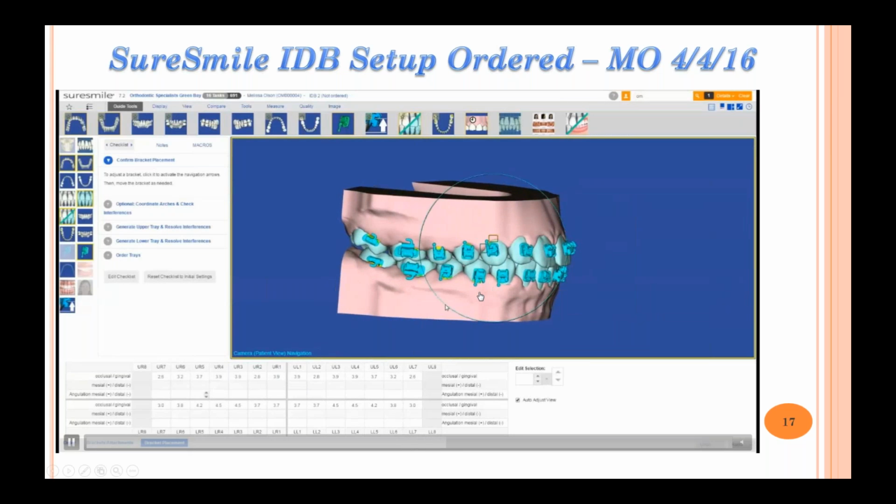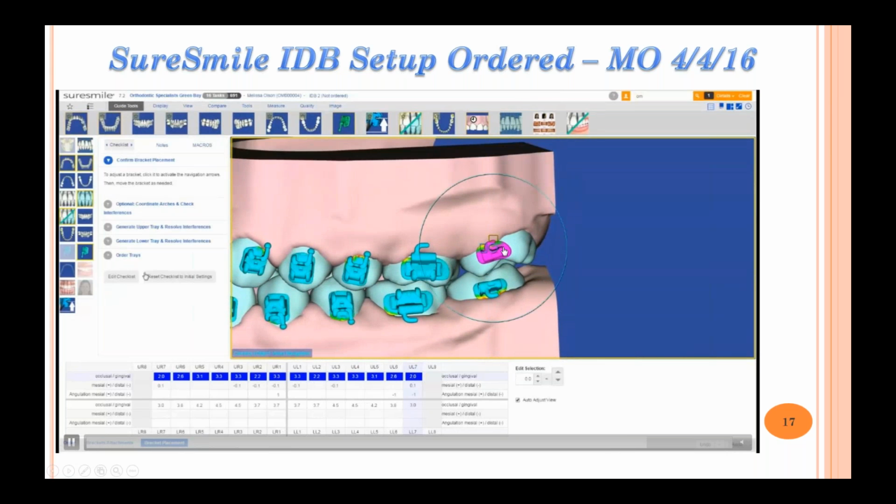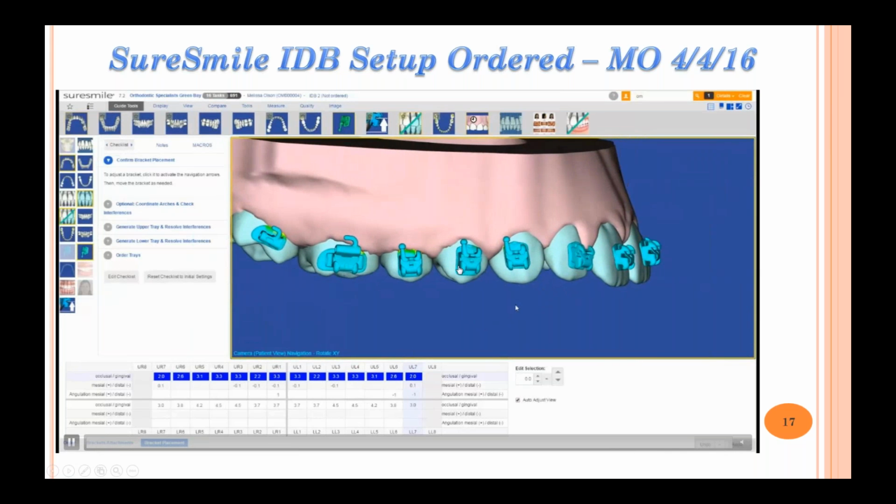All right, so watch right here, I'm moving these brackets down because these are showing you gingival penetration. It starts off with green, then yellow, then red. All right, it's going to move more occlusal here. Just watch this. There you go. And this is a key factor here because we can actually position some of these brackets a little bit more gingivally, all right, because the SureSmile software will find the best 2-point contact.